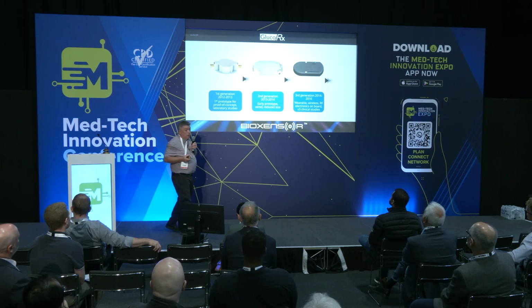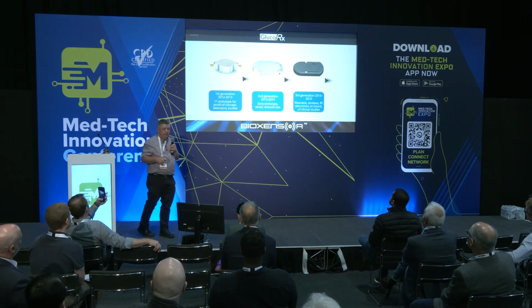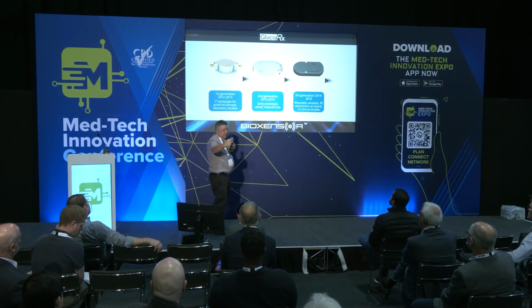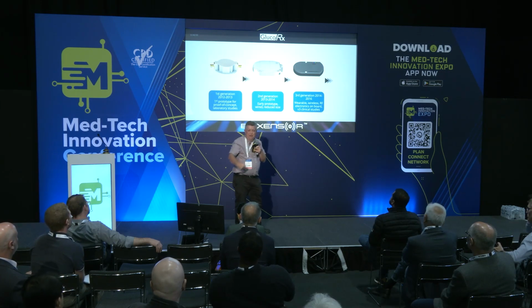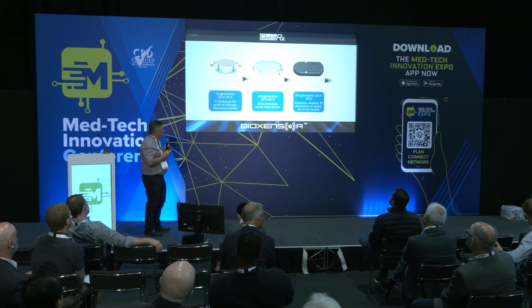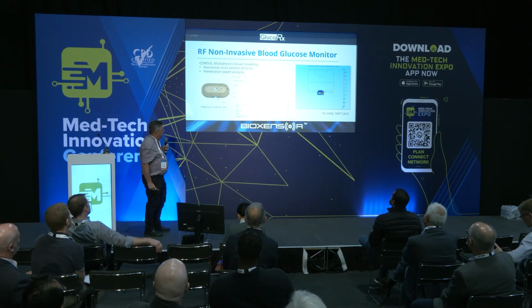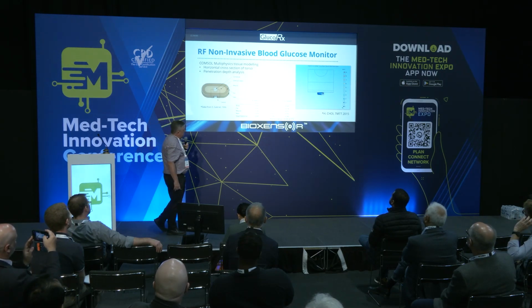The first ones were wired, you know, so they did involve somebody sitting next to a box of electronics or moving around, as you do in a hospital or clinical ward, with one of these trolleys with all the electronics on it. And then we moved to a wireless solution. And we've done the modeling of this, so we're not doing this in the dark, because we are experts at material interaction at high frequencies.